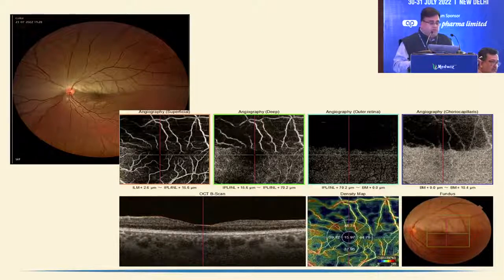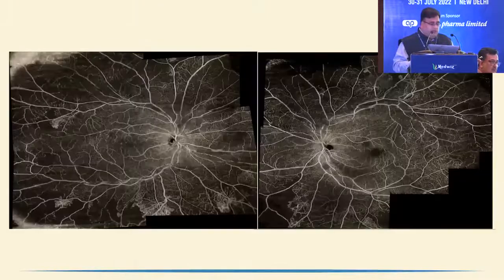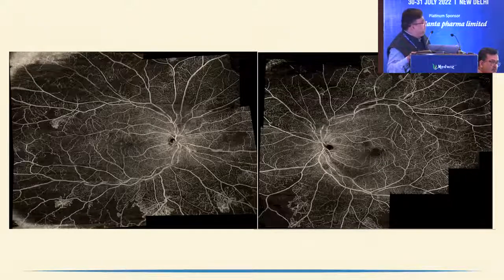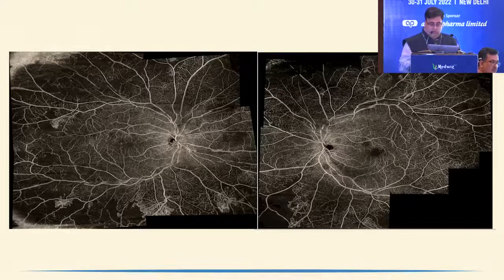You can diagnose different conditions on OCT angio. It has become so close to what you used to get in FFA images. You can see this neovascular complex in a wide field OCT angio image very beautifully, with non-perfusion areas in a patient with PDR in both eyes. So such kinds of images are possible, but the future doesn't stop here.